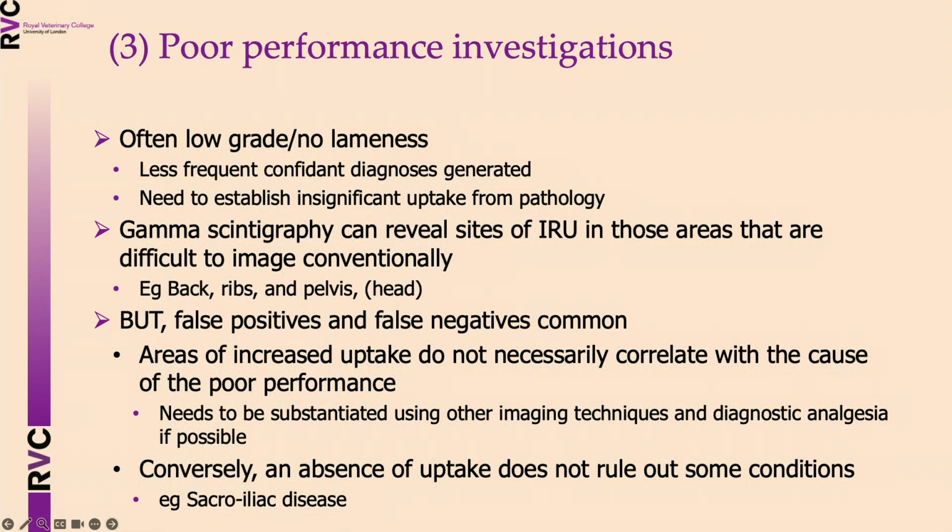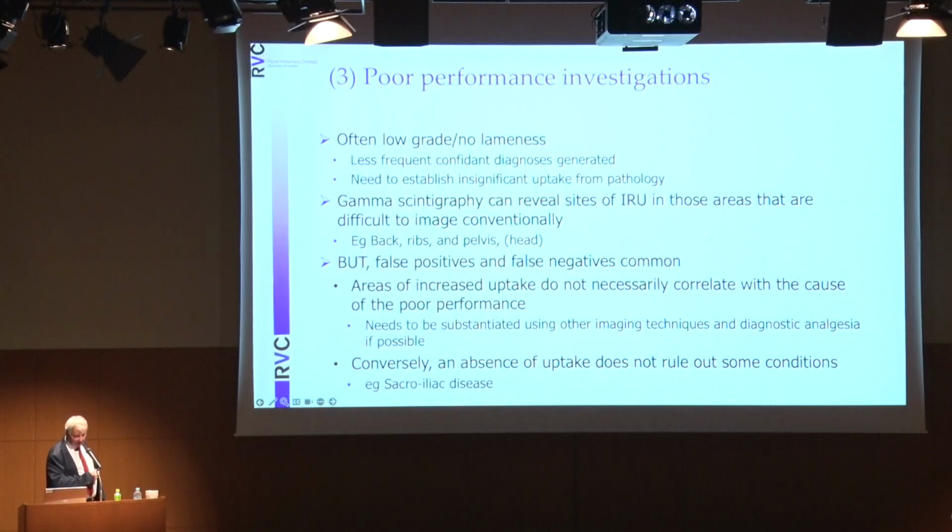So many of these cases show no abnormalities on scintigraphy, or sometimes even worse, false positives.